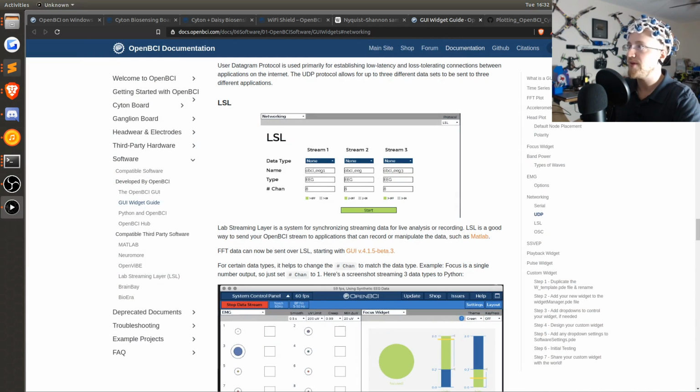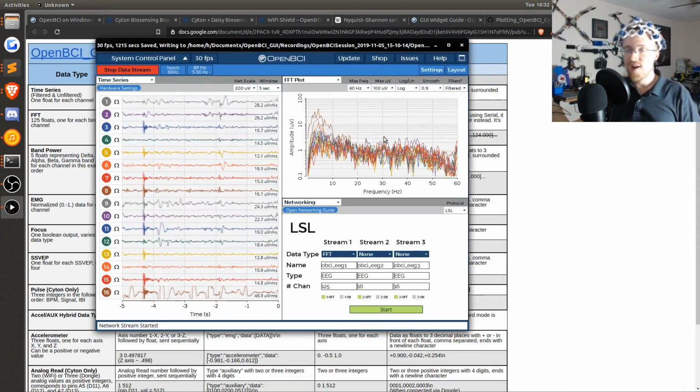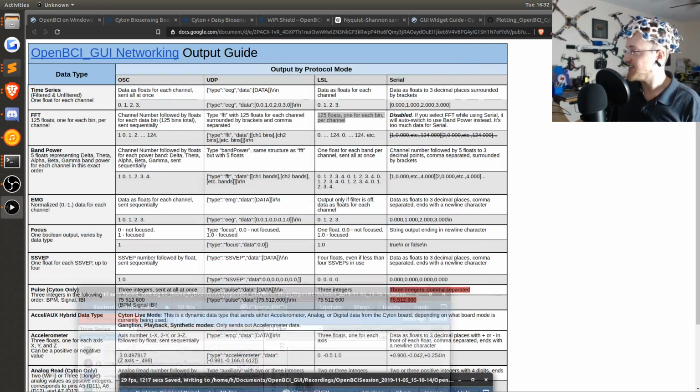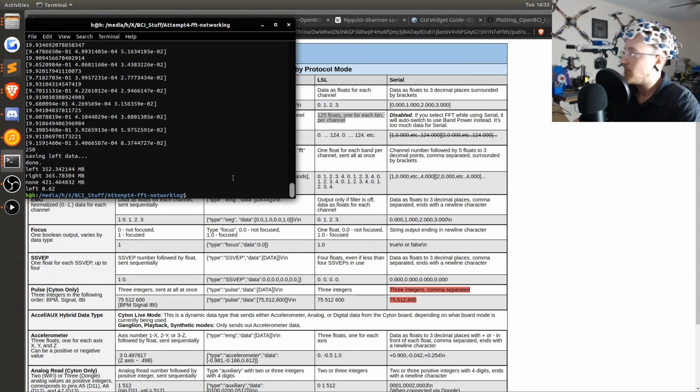But then eventually over email, yet again, I was given this, which I think should be shared on that page personally. Basically it just says you're going to get 125 floats, one for each bin per channel. And as I'm looking, it's like, oh, okay. So really what I want to throw in here is 125 for the channels. And once I did that, everything worked. So to show you an example of that, what would it be? Python 3.2.